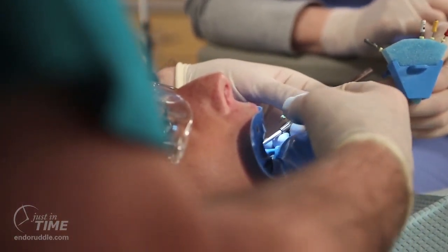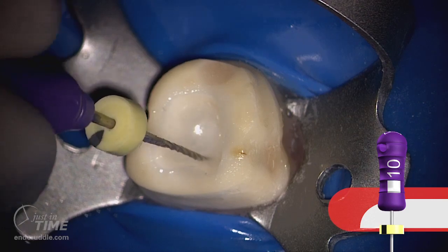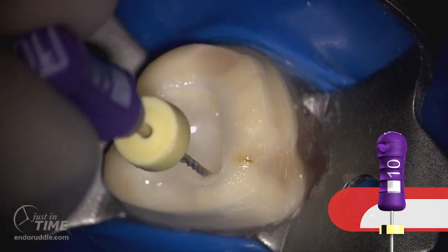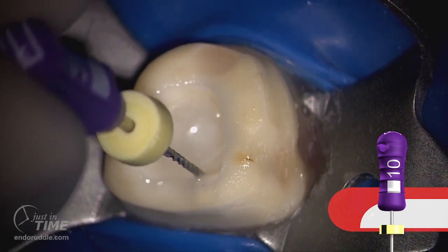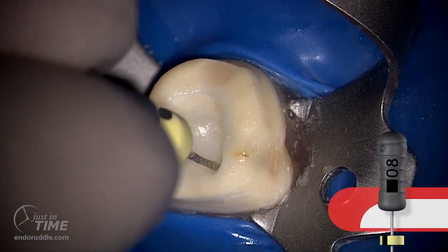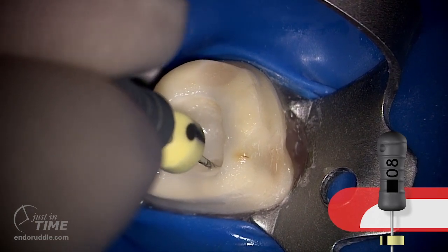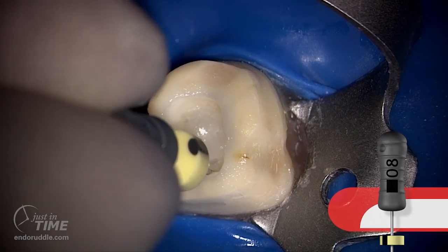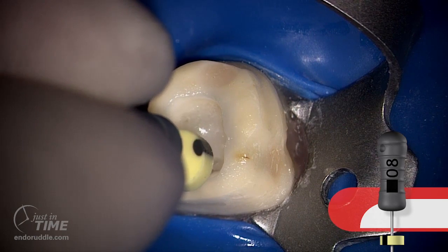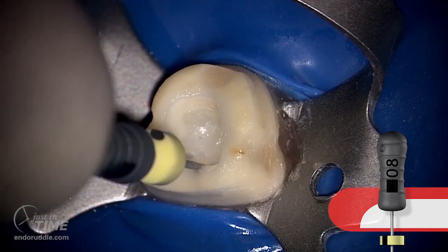Let's talk just a little bit about glide path management. It's really important to secure canals. This means that any given canal is essentially empty and has a smooth, reproducible glide path before we ever entertain shaping canals with rotary files. In this instance, the canals are longer, narrower, and more curved and recurved. So I chose to drop to an 08 file to reach length. Once you've got the 08, use gentle, partial reciprocating motions to try to explore and discover the true pathway to the terminus. When you get a little catch with the 08 file, use gentle, short amplitude strokes to begin to encourage canal widening. This will also serve to drag viscous chelator into the canal so that you have a smooth, passive, reproducible glide path.